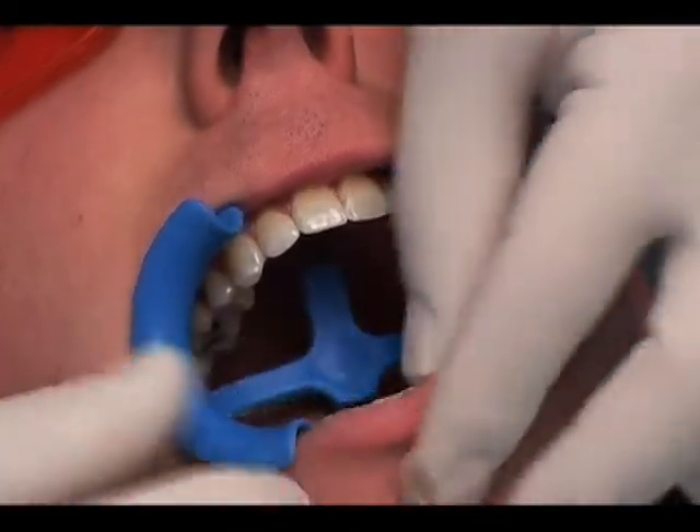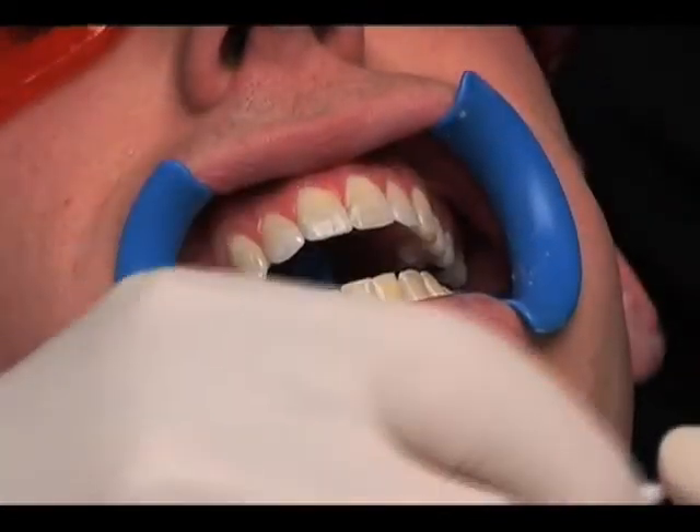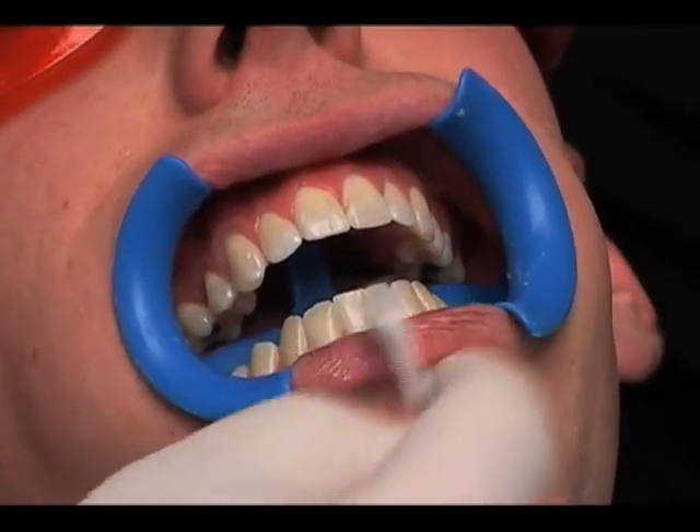Place cheek retractors and cover exposed lip surface with petroleum gel. Be certain as much of the lips as possible are retracted by the cheek retractor. Cotton rolls may aid in protecting the lips from coming in contact with the whitening material.